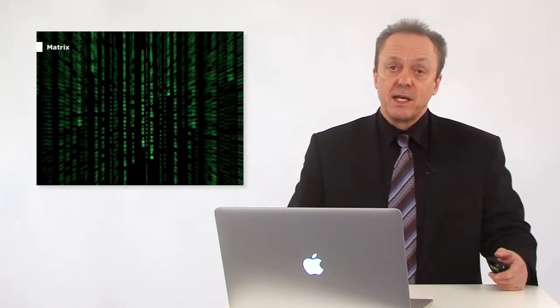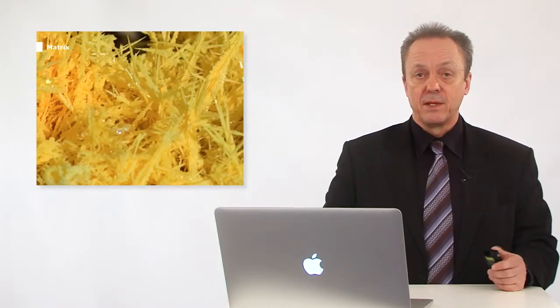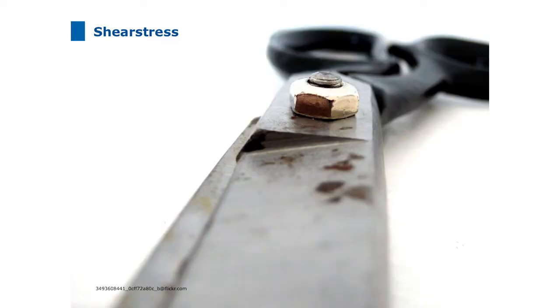So what exactly is this thing that we call the matrix? Up to now, we are more familiar with the term as something virtual. Our matrix is, however, tangible and for our Honigum Pro Light shown schematically here. This interlocking within the crystal structure ensures the stability, which is intended in the region of the preparation, especially after the application. The material stays where you want it to stay as long as you want it to stay. But as soon as you exert a force on the material, it immediately starts to flow.